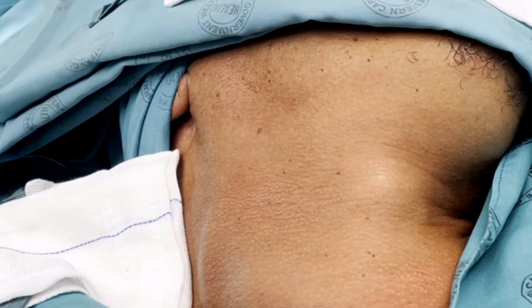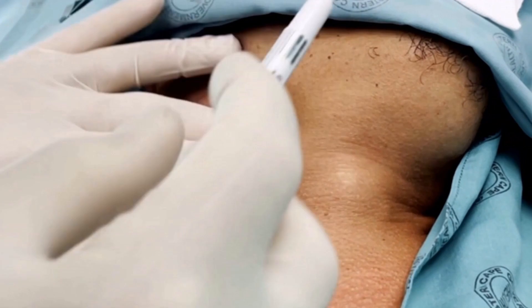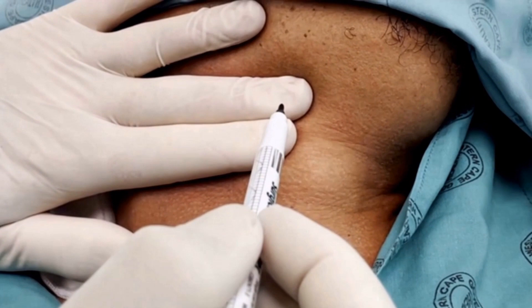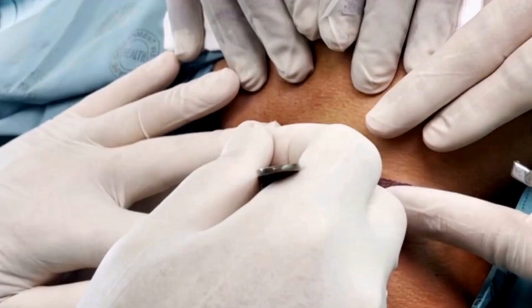The patient is placed supine with the head turned to the opposite side. The corner of the mouth and the lower mandible should be left exposed so that one can observe twitching of the corner of the mouth should the marginal mandibular nerve be mechanically or electrically stimulated. For the same reason it is important that the patient is not paralysed for the duration of the operation. Mark your incision at the level of the hyoid bone in a skin crease about 2 finger-breadths below the mandible.